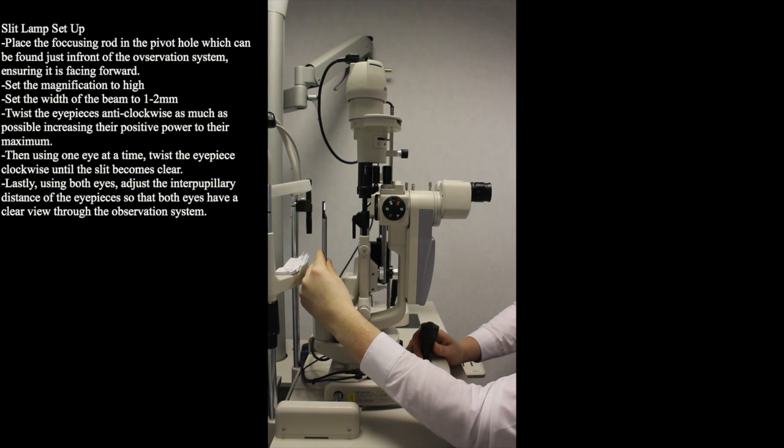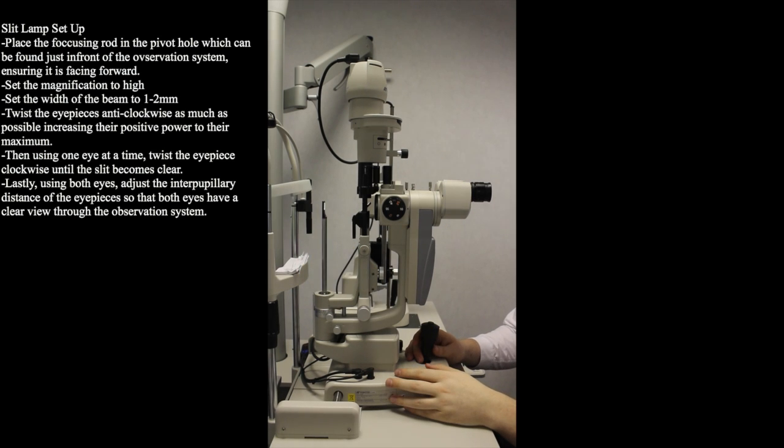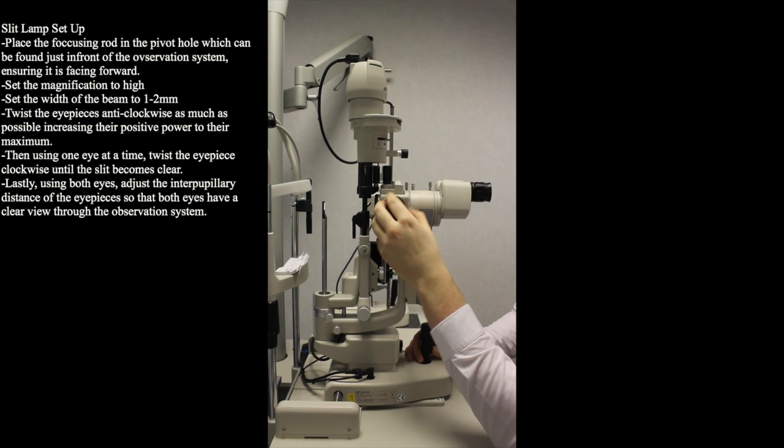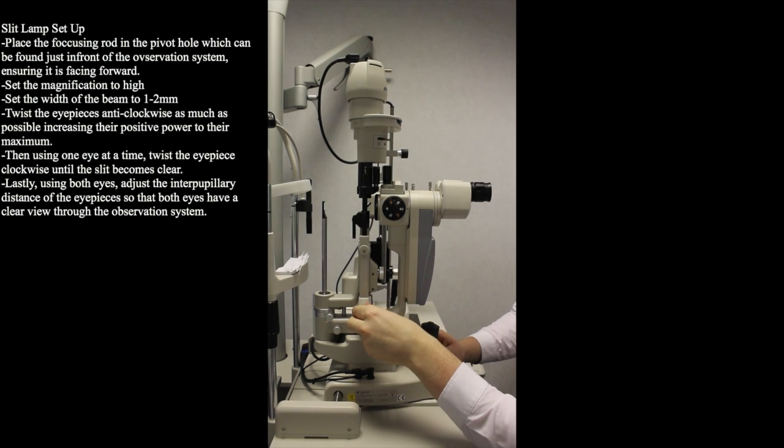It is important that when putting the focusing rod into the pivot hole that it is facing forward to prevent one eyepiece being focused at a different angle to the other. Firstly you must adjust the magnification to a high magnification and decrease the width of the slit.